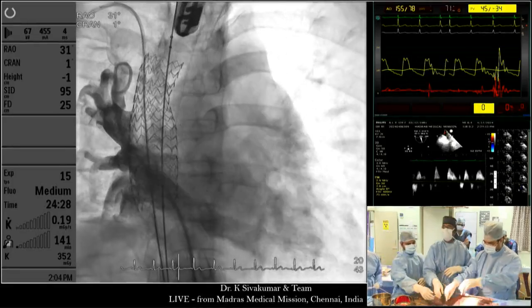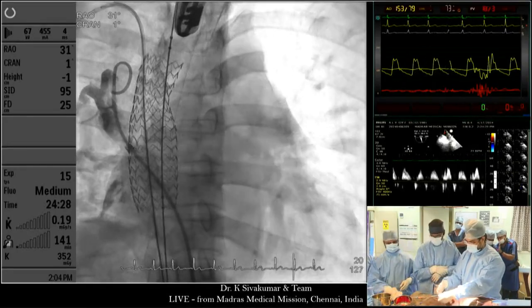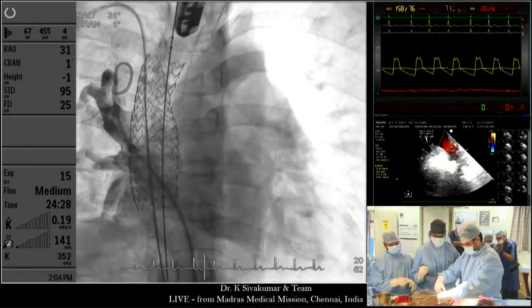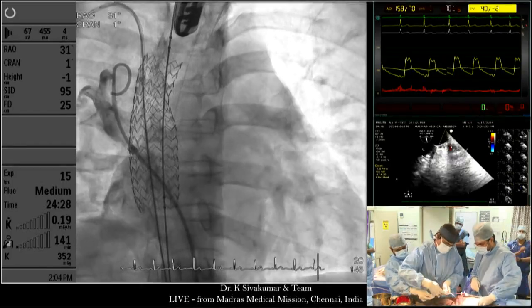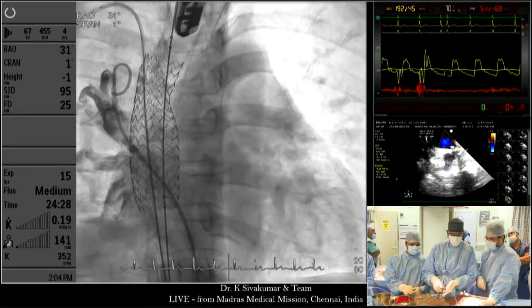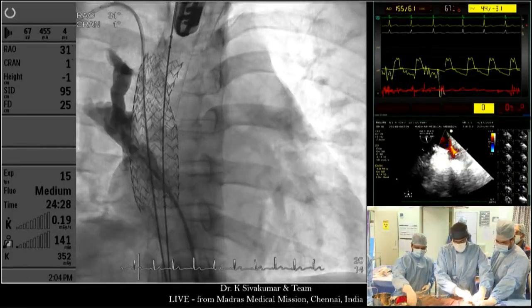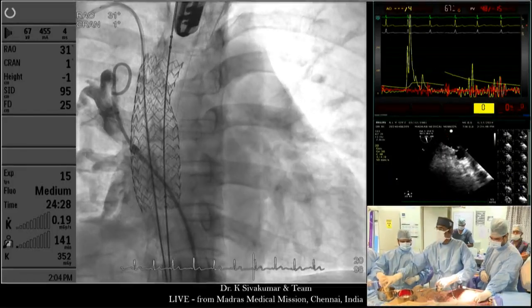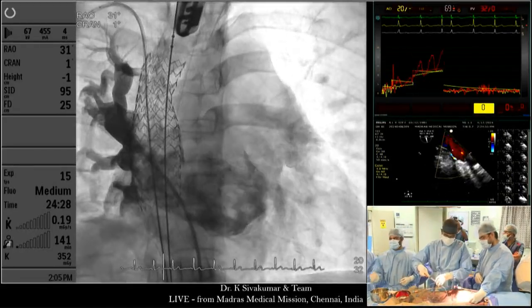Just open this one. So this is the right upper pulmonary vein, laminar flows. I have tightened the angiographic syringe too much to the pigtail, so I am undoing it. So now I am getting two pressures, one of the right upper pulmonary vein and one of the left atrium. Flush. Show the pressures in scales of 20 and show the pressure big.